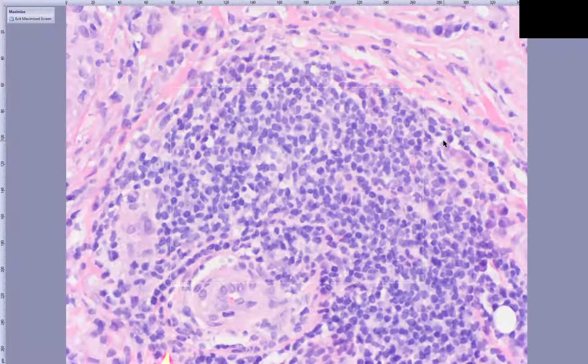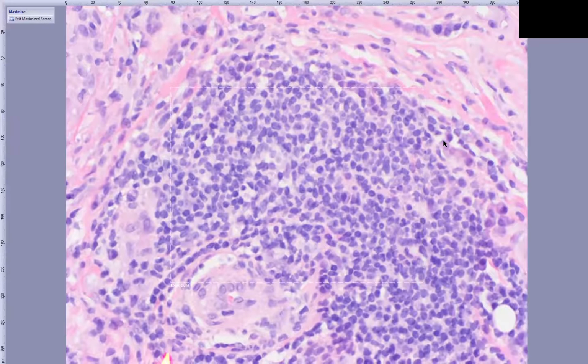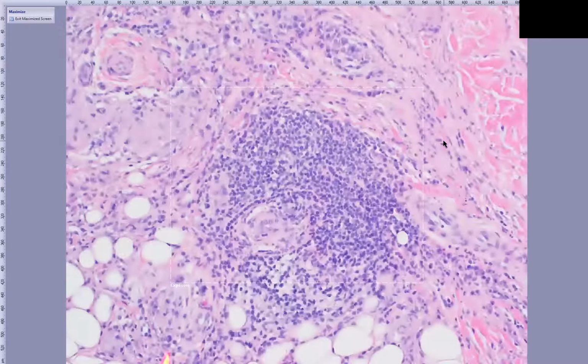In NXG, we had clearer zones of paucicellular collagen degeneration replaced by cholesterol clefts, whereas here, you can still make out the collagen bundles. Okay, so the collagen bundles are largely still preserved, but you do have that fuzziness of the outlines of the collagen bundles.